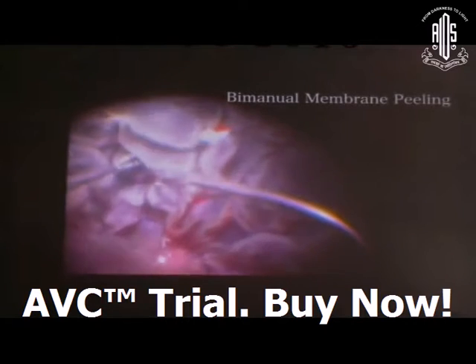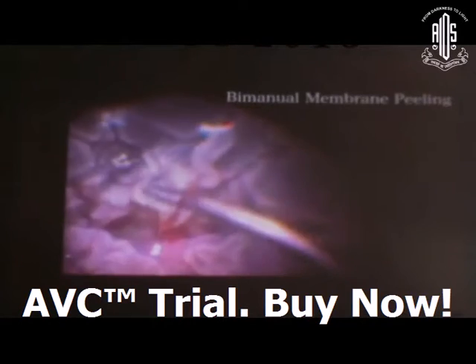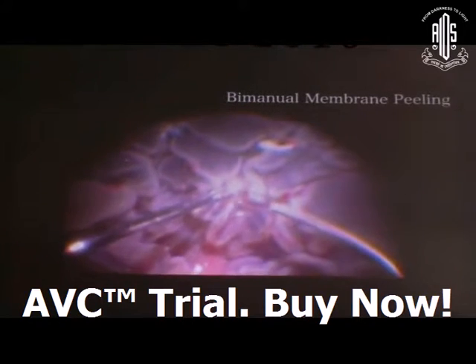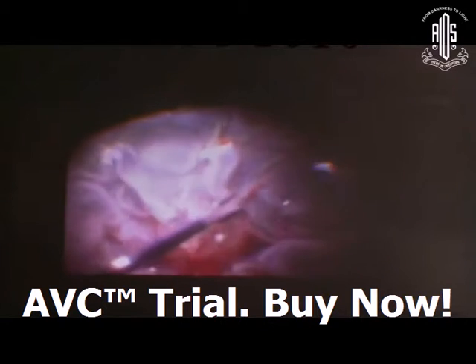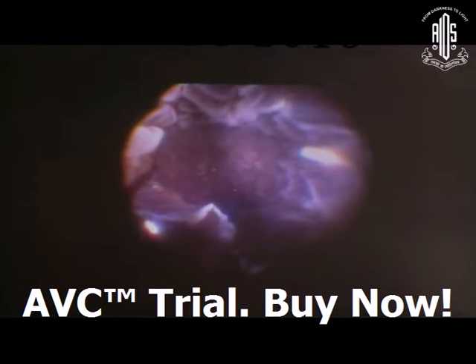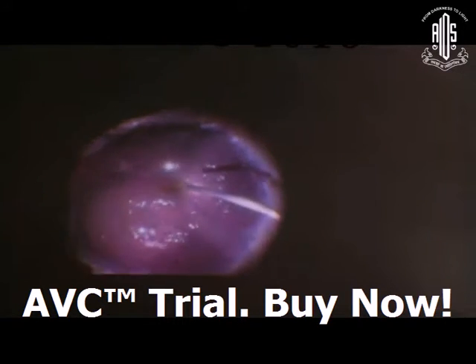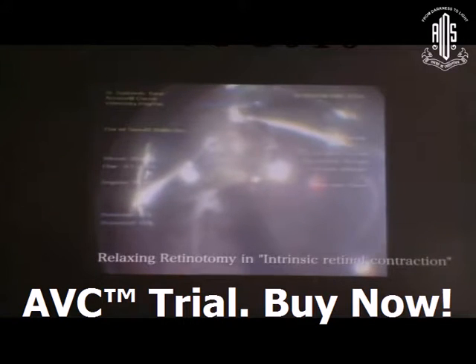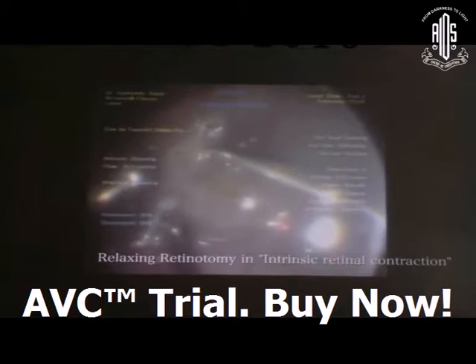In a PVR D2-like situation, I am releasing the fixed folds with the help of a grasping forcep and the Allen peeling forcep. After releasing the fixed folds as much as possible — not necessarily 100% — you can assess the area after injecting PFCL. In this type of situation, intrinsic retinal contraction may also be realized.